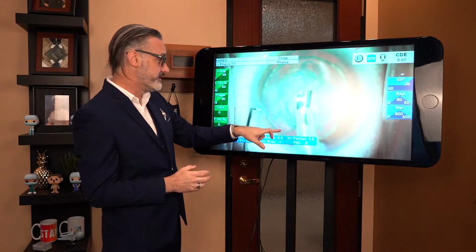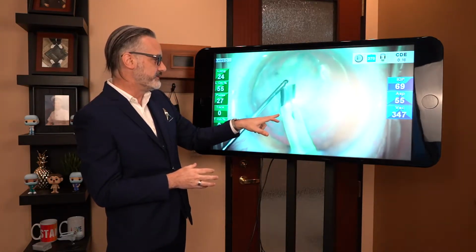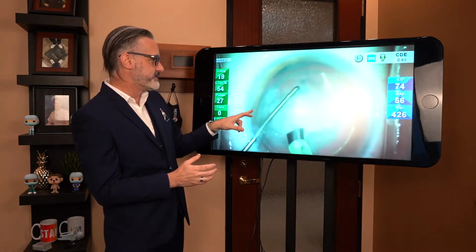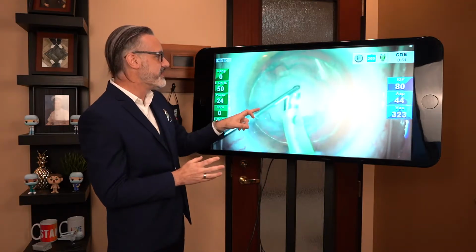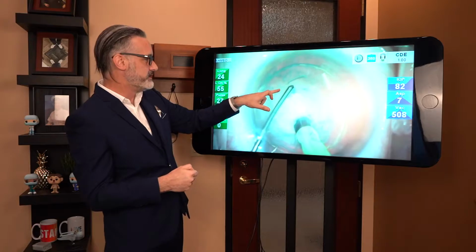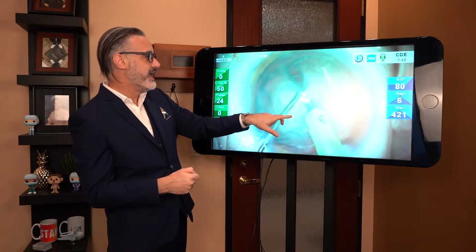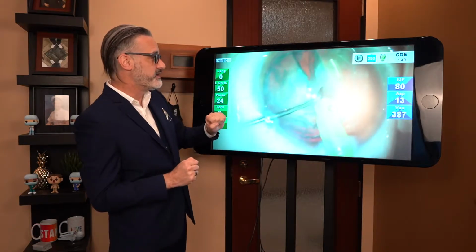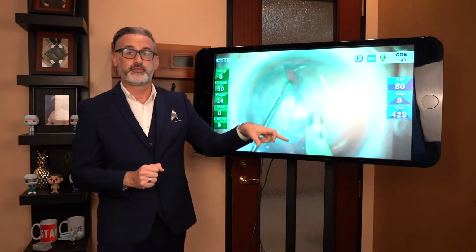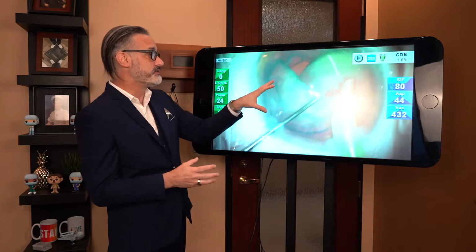And this little tool there, remember, this isn't large, to be able to put the big eye on the screen. This is a nice little vacuum cleaner. A little suction tool that goes in, and you can see the camera is moving around quite a bit. But then the doctor has the two tools in, one scraping away the lens material, and then going in and making the suction. And what had just happened there was that by putting the vacuum in, they were able to cut vertically down through the cornea, but also through the cataract itself to be able to remove it.